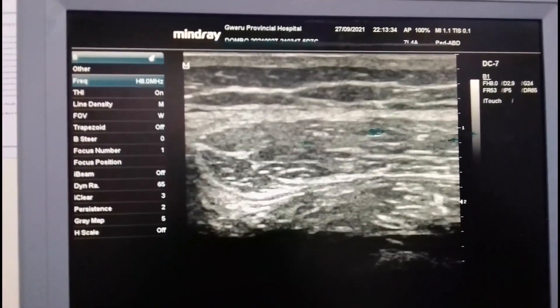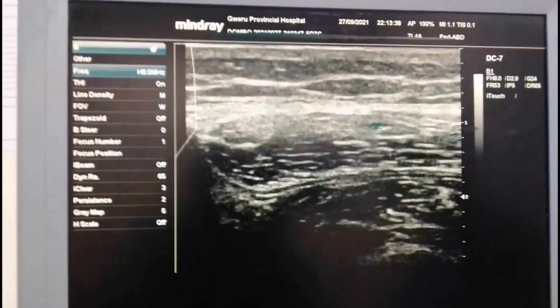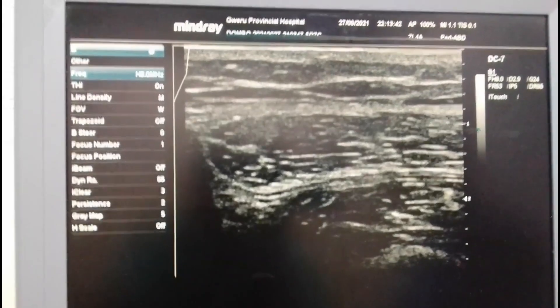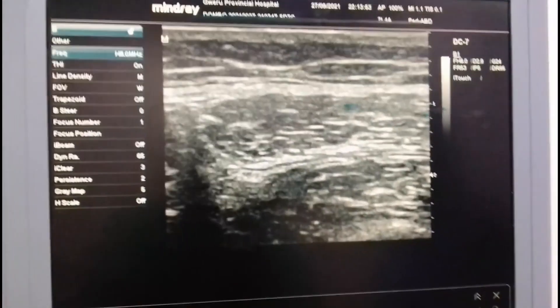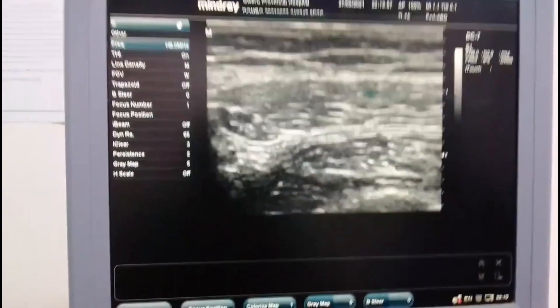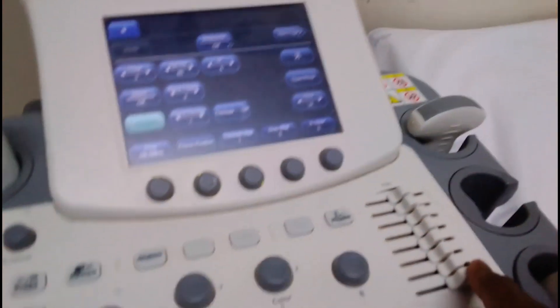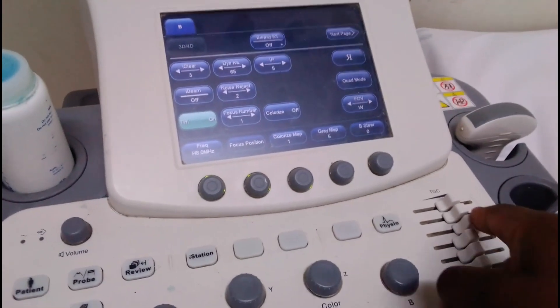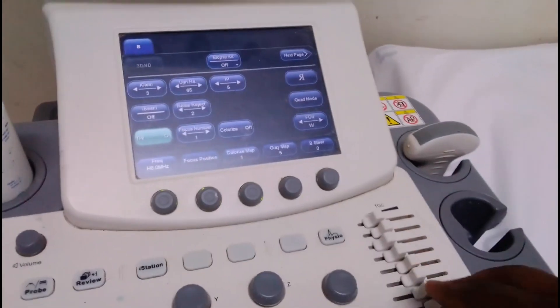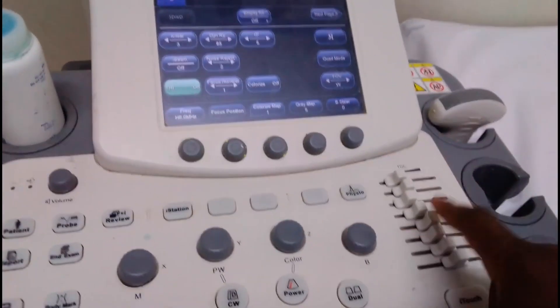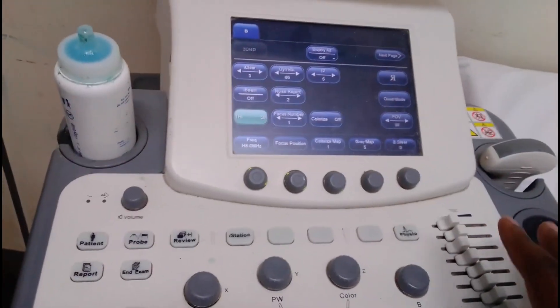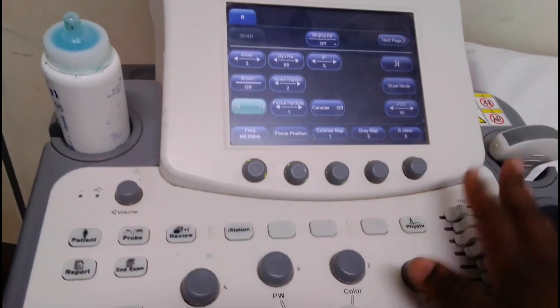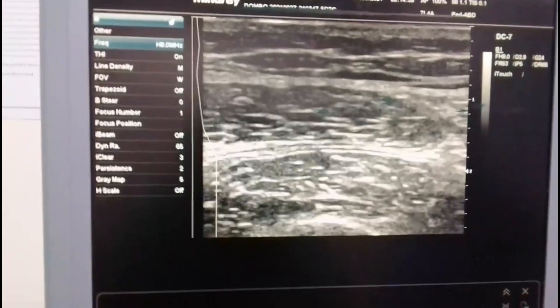You need to make sure that when you are doing your scan, you try to align the TGC keys in a way that produces an image that is almost homogeneous. You can see what is happening now — this is exactly what we don't like. The technique here is for you to keep on moving until you find a nice image that is almost homogeneous. We don't have a specific arrangement for a different organ, but at the same time, different body parts need different alignment of the TGC. The problem with most sonographers or radiologists is they just don't touch these TGC keys.